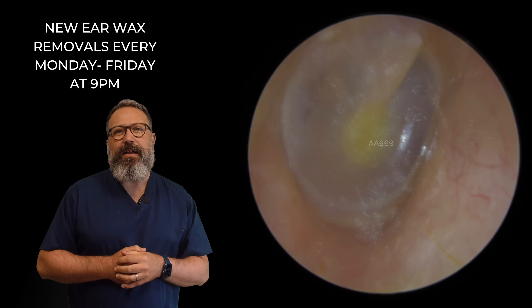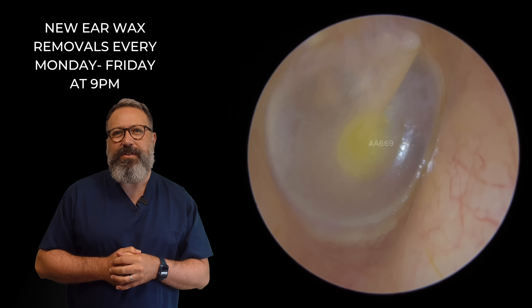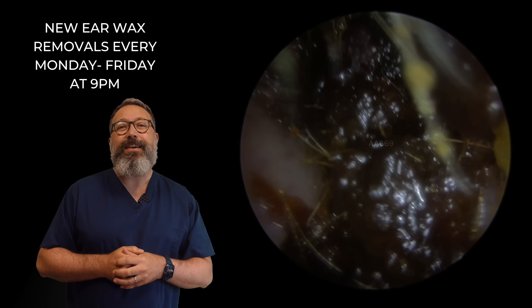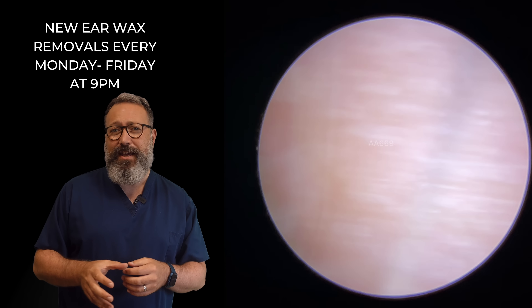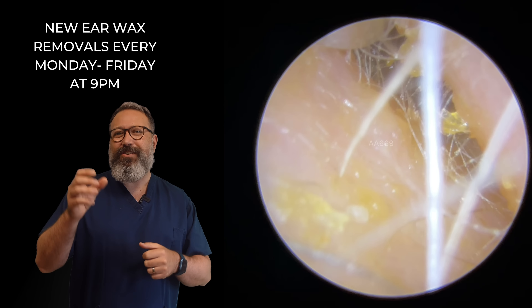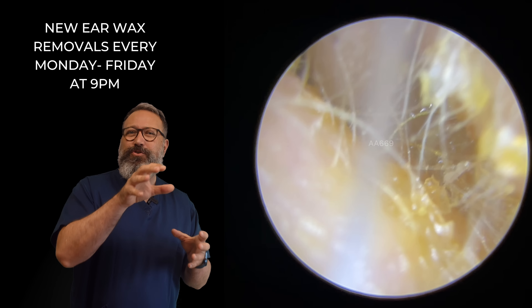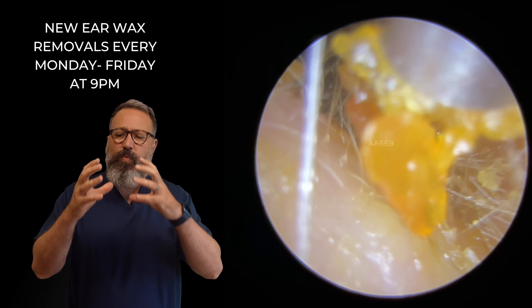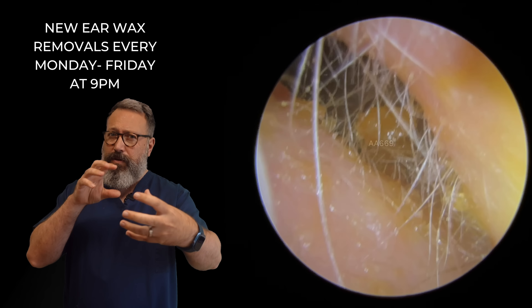You can see that little piece of wax there at the entrance — this is what it looks like afterwards. So a very, very different ear canal there. So this is the other ear canal now. We've got a much longer piece of wax in here that we're going to need to work down. This is complicated slightly by the fact the entrance to the canal here is very narrow. So what we've got is a slightly wider canal and a longer piece of wax.